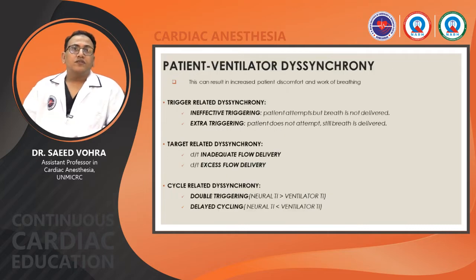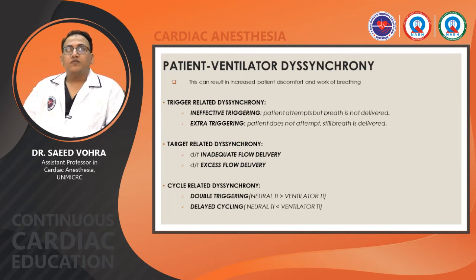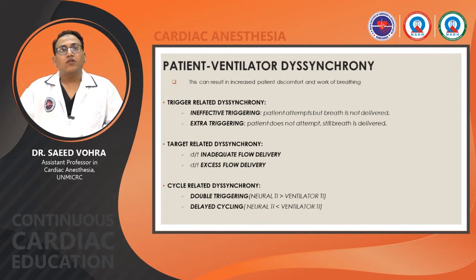Now the patient ventilator desynchrony. If the patient on mechanical ventilation has started breathing on their own, then you may face this problem of desynchrony. If the clinical condition allows for sedation and paralysis, then desynchrony can be avoided. However, in all clinical conditions, the patient can't be sedated, relaxed, and paralyzed. So you may face this desynchrony.